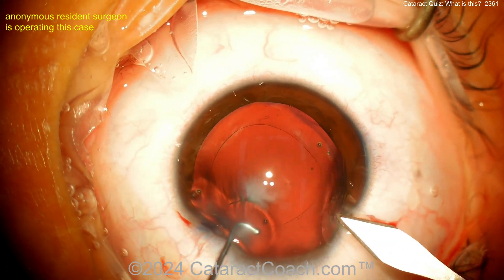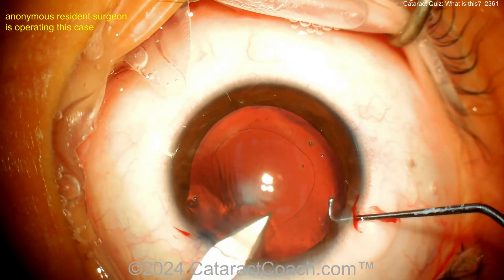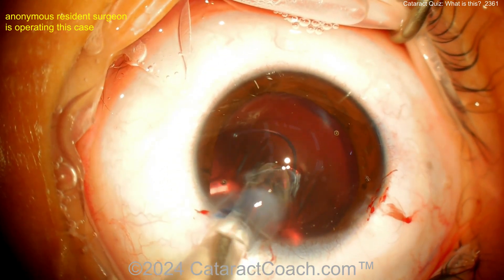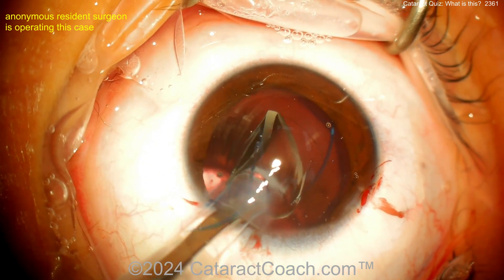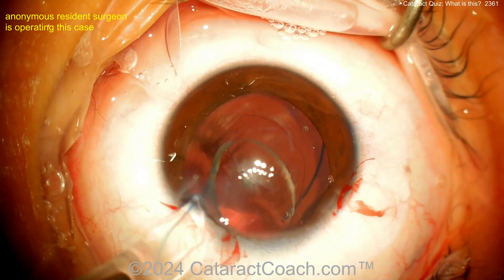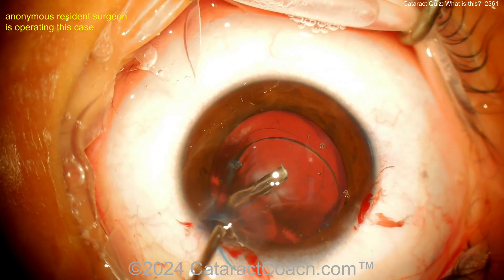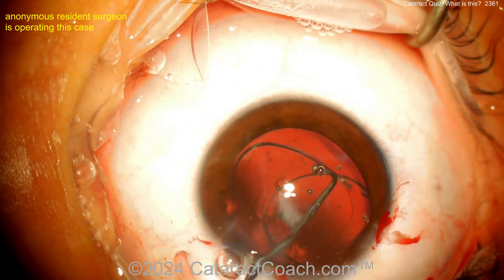Looks like the surgeon is enlarging the incision to get an IOL inside the eye. A three-piece lens is going inside the capsular bag. There's the 7L rule — leading haptic number seven, trailing haptic going inside, and that's the capital letter L, so the IOL is in the correct orientation. As we know, if the haptic configuration looks like the letter S, that indicates a mistake you don't want to make.